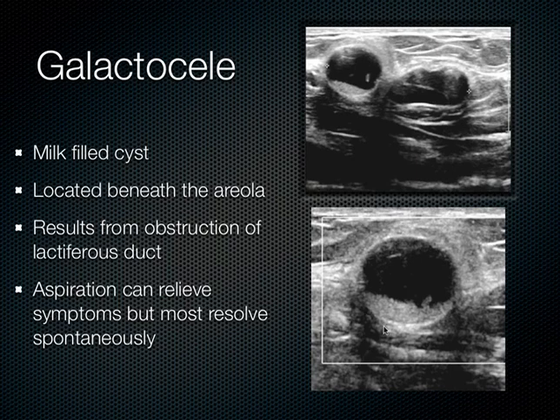When galactoceles are new and composed mainly of milk without any separation, they appear more as solid masses with increased posterior acoustic enhancement. As the galactoceles age, the fat, water, and protein content separates and they become more cystic in appearance. Typically with ultrasound, a fluid debris level can be seen, and as the patient moves around, this fluid debris level can shift.